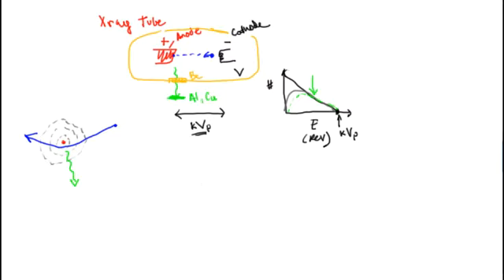Let me plot a little graph of the voltage over time. This is time and the volts coming in. You want a constant voltage on the tube, but you can't quite achieve that.